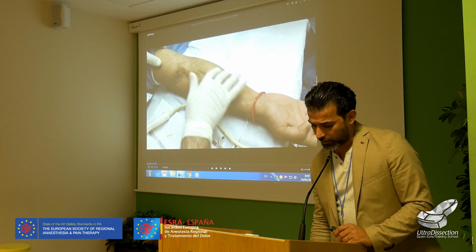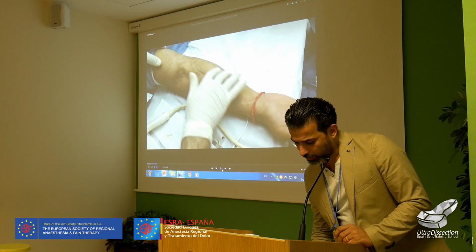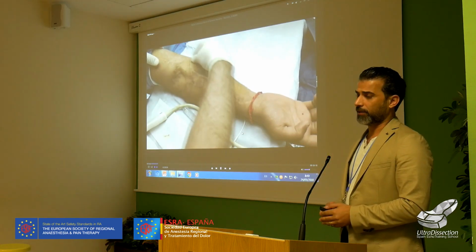So we'll show you the pain here in the medial aspect of the forearm.